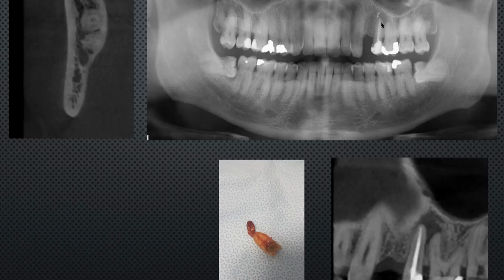And then looking ahead, particularly if you've got anterior mandible teeth that are beginning to fail, thinking about the long-term prognosis of the whole section rather than just one tooth in isolation, because they can be quite tricky implants to place and to restore. You want to make sure you're taking the whole site into consideration and not just the implant site. But I think we've covered everything.